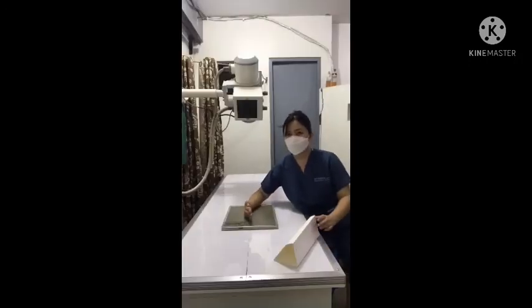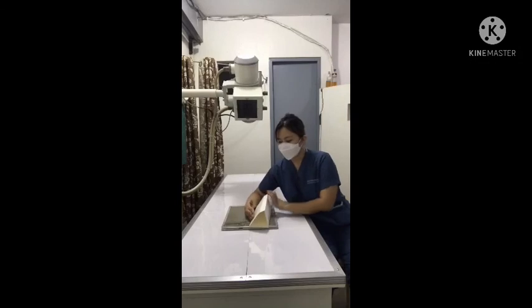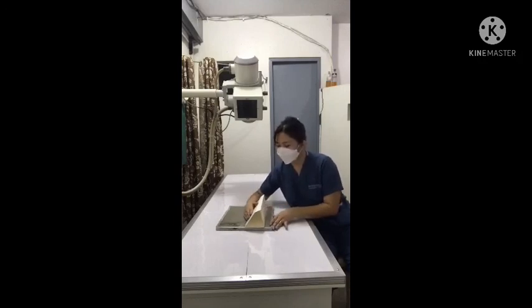The Clements-Nakayama method has two positions. First is the hand in ulnar deviation while resting on a 45 degrees box wedge, and second is the elbow end of the IR turned 20 degrees away from the central ray if ulnar deviation cannot be achieved by the patient.